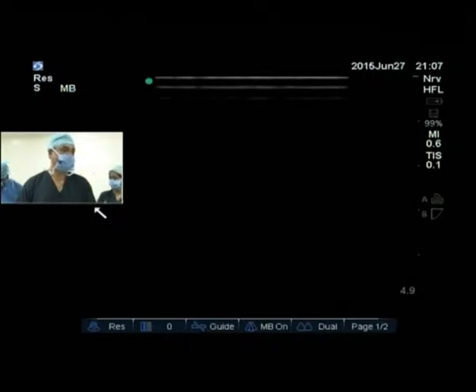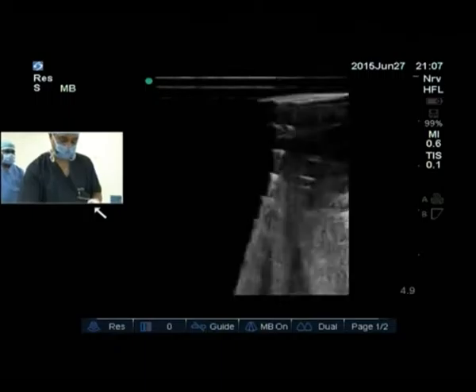And I'll also do a popliteal sciatic, but we will not go live with the popliteal sciatic block because Professor Chan has just demonstrated the popliteal sciatic block to you. So what we will be doing live is the adductor canal block.